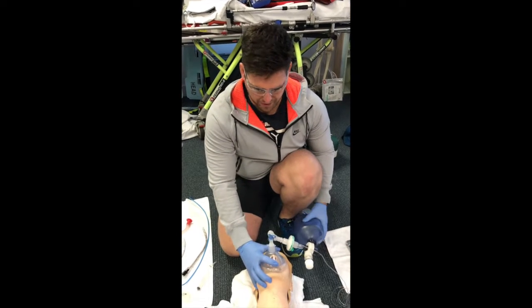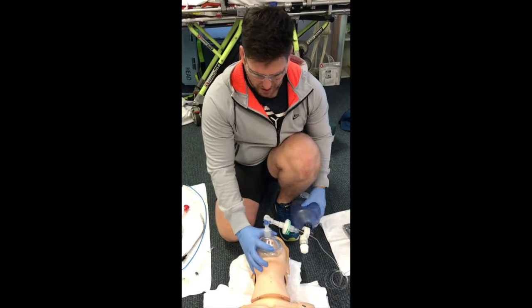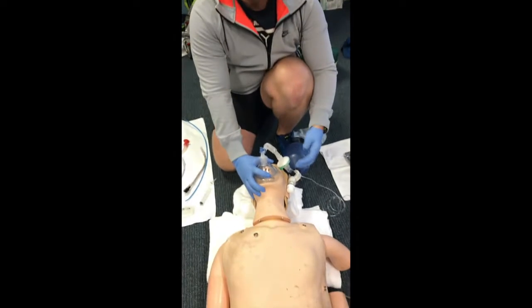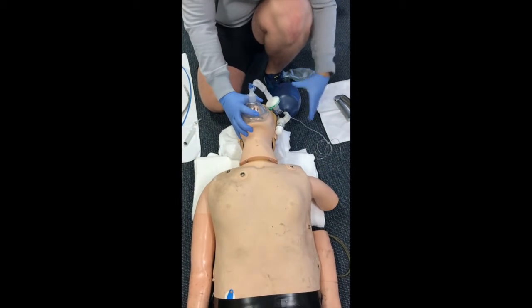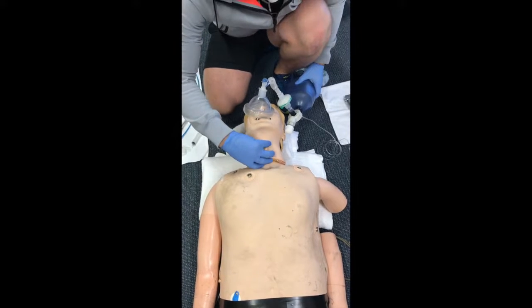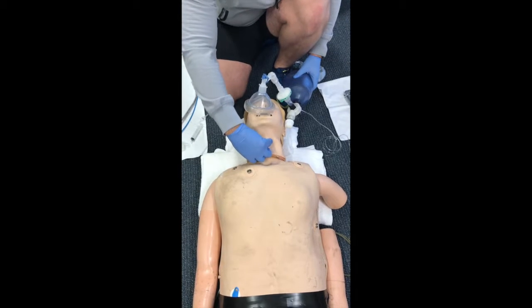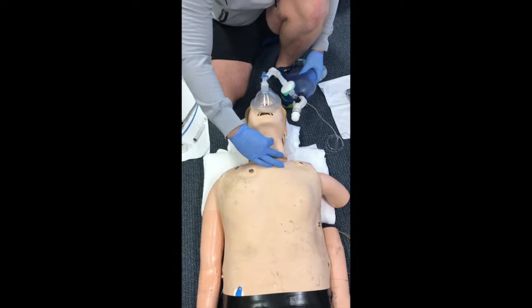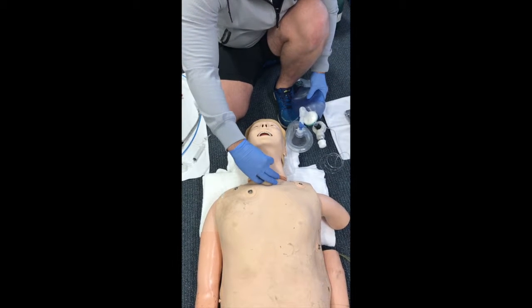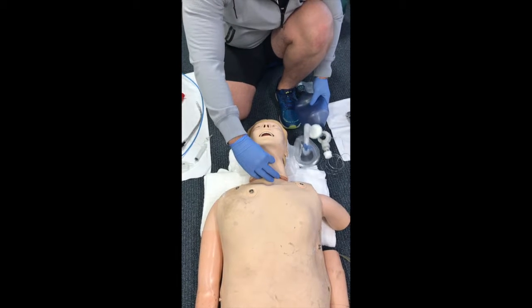Okay, so for my first attempt at intubation, I was unable to pass the tube, and it was difficult. So now I'm going to change some things. I've already got the patient in the optimum position, having them ramped up. But this time with my assistant, I'm going to get them to apply some external laryngeal manipulation. So I'm going to get them just to position their fingers here, and whilst I intubate them, I'm going to place my fingers on their fingers and manipulate it into a position so that I'm able to pass the tube.